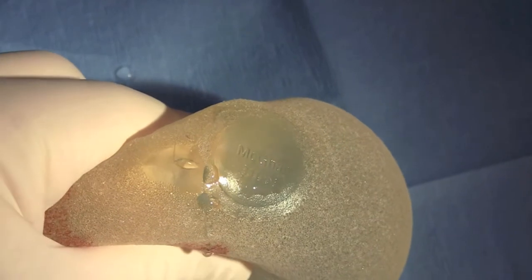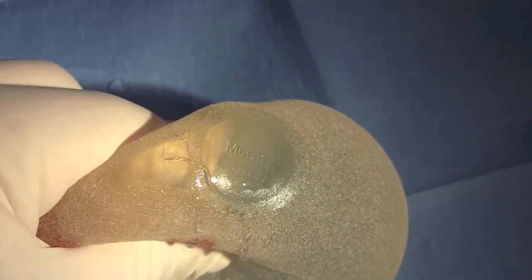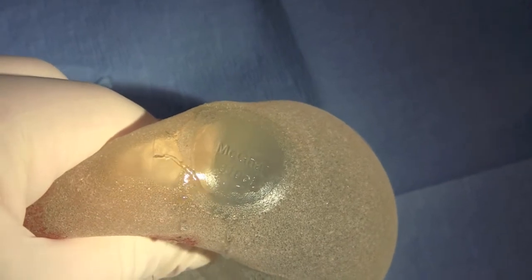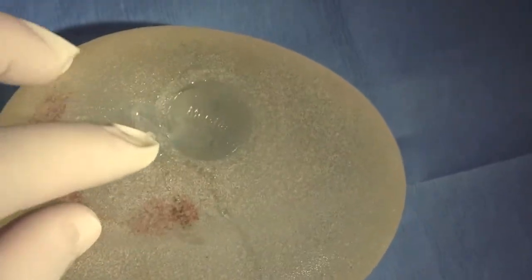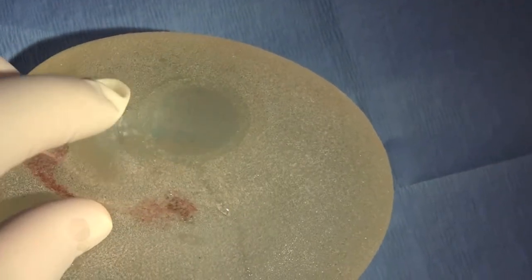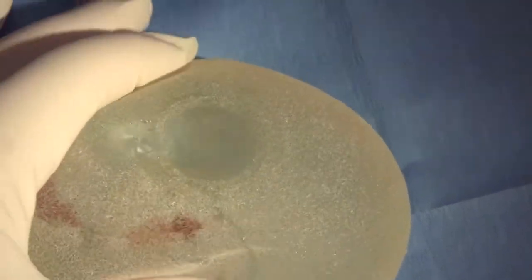The way implants are made is there's a mold and the mold is dipped in liquid silicone. Then the silicone is removed from the mold and a patch is placed. It's just at the rim of the patch where it meets the regular part of the implant that this leakage is occurring.